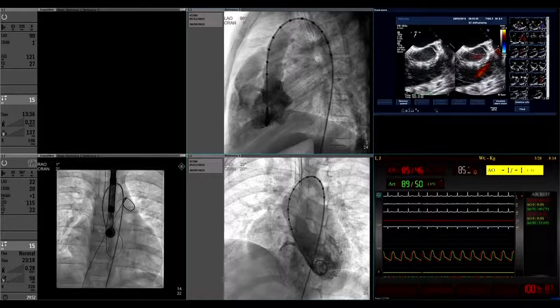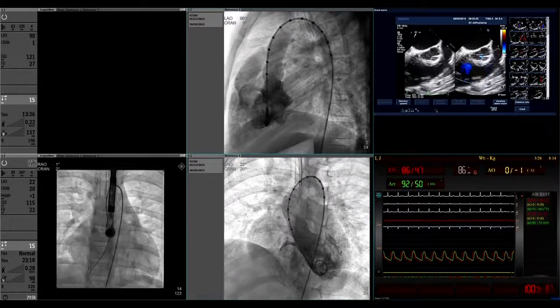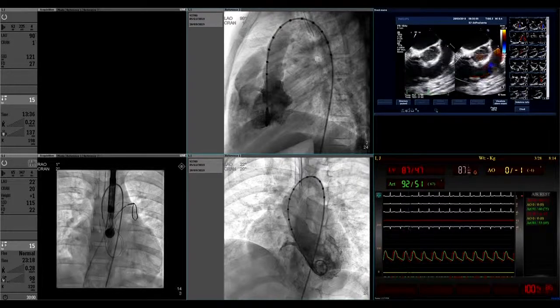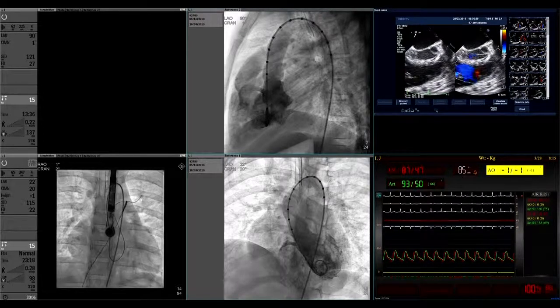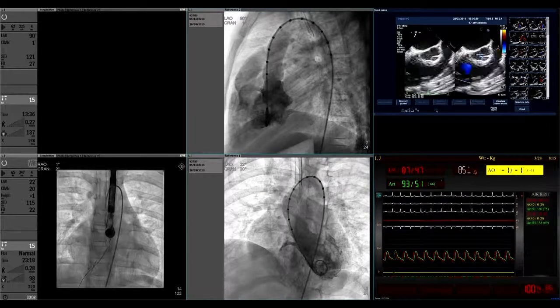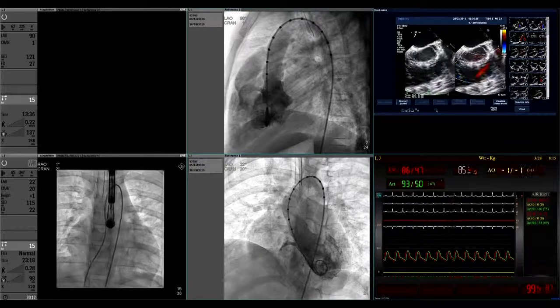And so for this case, we worried about the tricuspid valve and some hypertrophy of the RVOT also. And it's the reason why we don't want to use the double disc device. We just need a single disc device. Do you agree with me? Yeah, true.